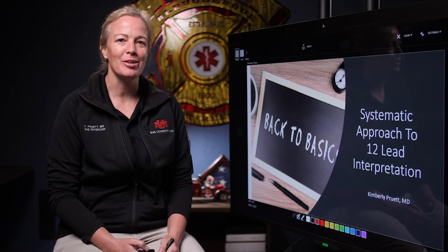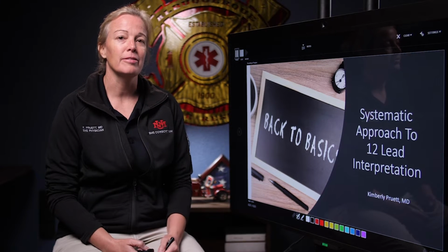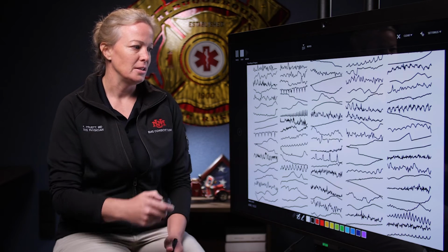Welcome to a fun new initiative starting with 12-lead interpretation. This is going to be the foundational lecture of basics of 12-lead interpretation that we're going to refer back to every week as we start to do weekly EKGs together. This is going to be the basics of 12-lead interpretation today.